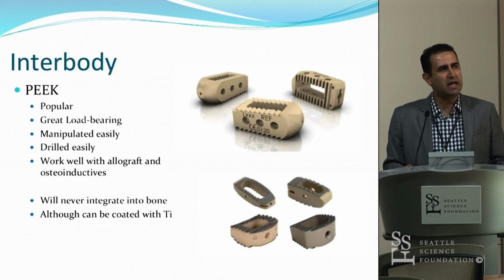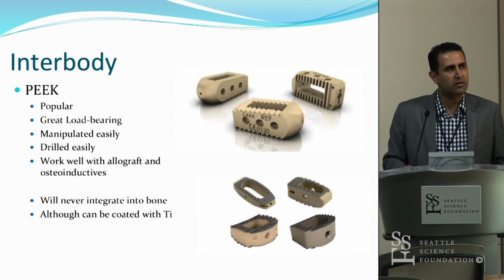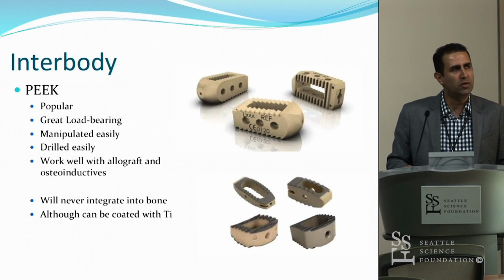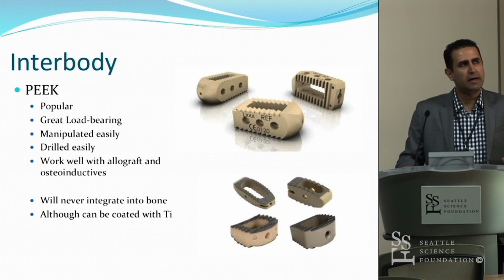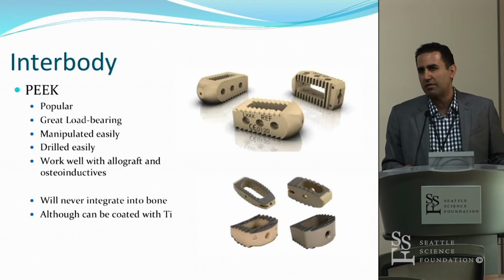Interbodies, the PEEK. So this is kind of our most popular implant. It's fantastic for load bearing because it can be shaped to whatever position you want. It's manipulated pretty easily into the disc space. You can drill it. It works well with allograft and osteoinductive materials such as BMP. The problem is it's plastic. It's polyether ether ketone. It will never integrate into bone.